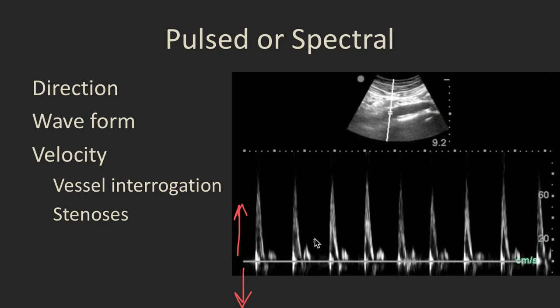We have a waveform, so we can see here exactly what's happening in systole and in diastole. We have quantification here—you see in centimeters per second this is 20, this is 60, so the peak is somewhere around probably 70 centimeters per second here. So we have quantification.